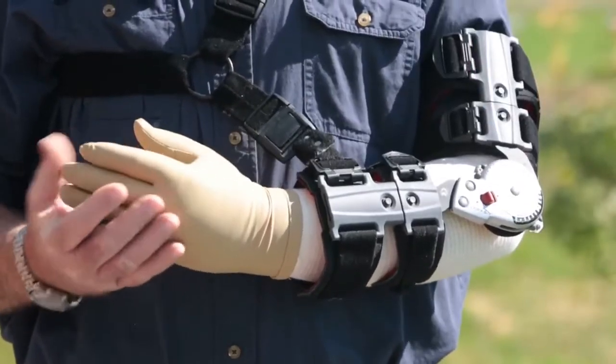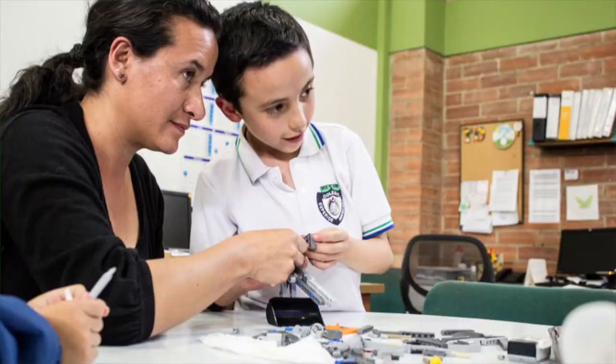Prosthetic limbs go from rudimentary to rad with an incredible new LEGO-friendly feature which lets kids build their own arm. The best part is that to these kids, it no longer seems like a prosthetic — just a new toy.